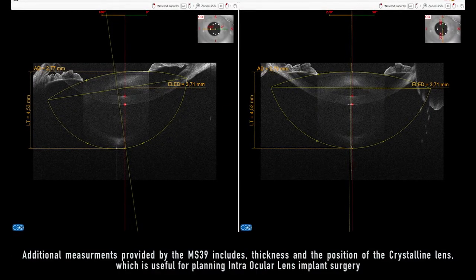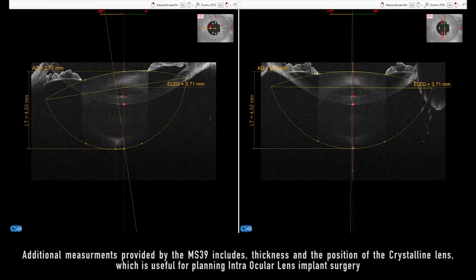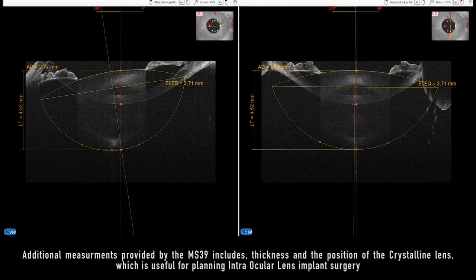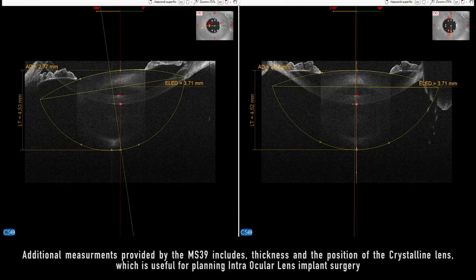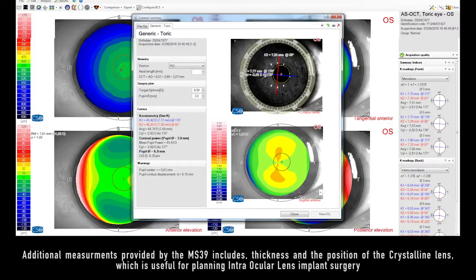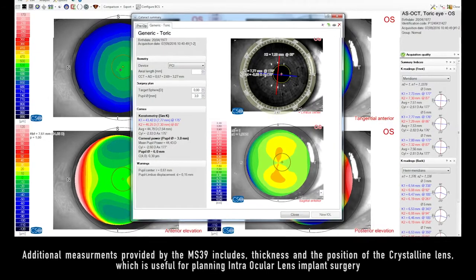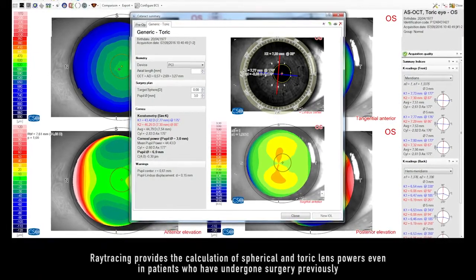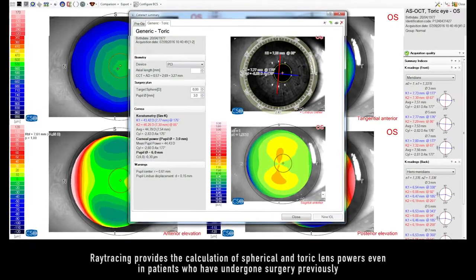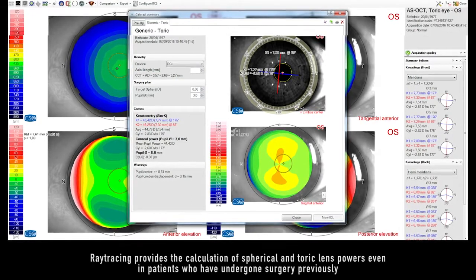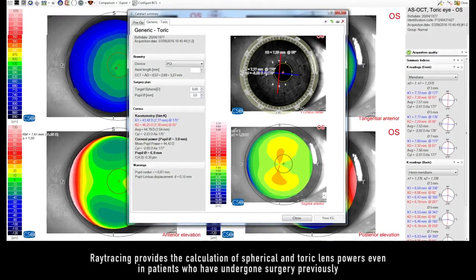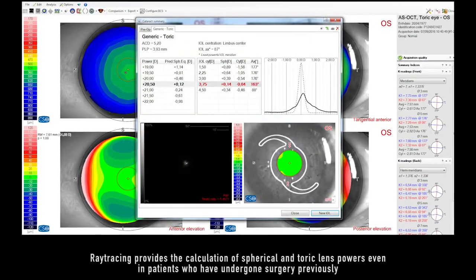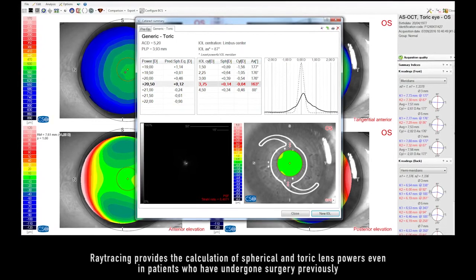Additional measurements provided by the MS-39 include thickness and the position of the crystalline lens, which is useful for planning intraocular lens implant surgery. Ray tracing provides the calculation of spherical and toric lens powers, even in patients who have undergone surgery previously.